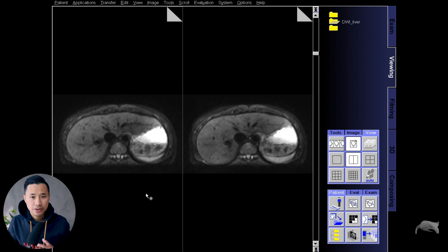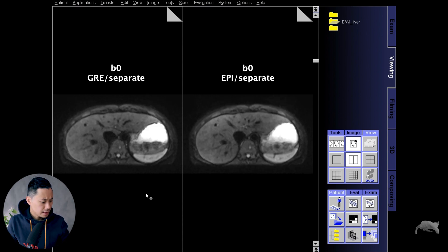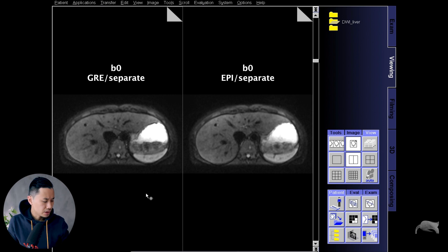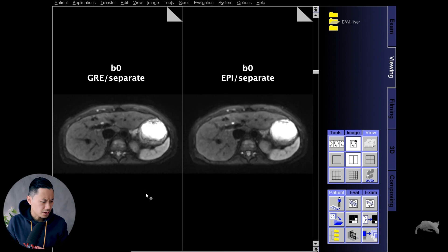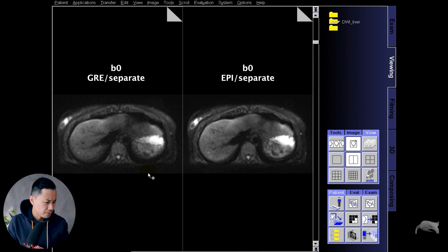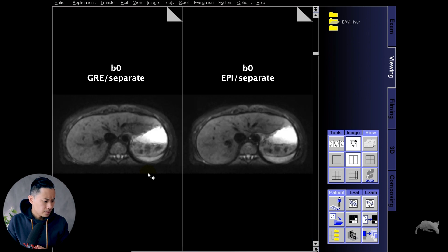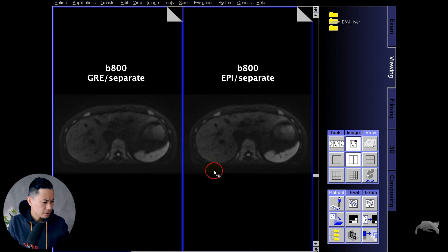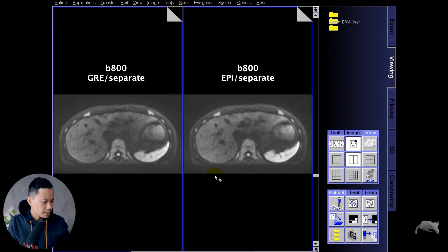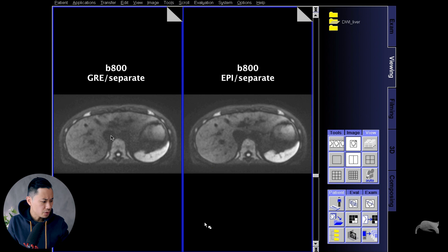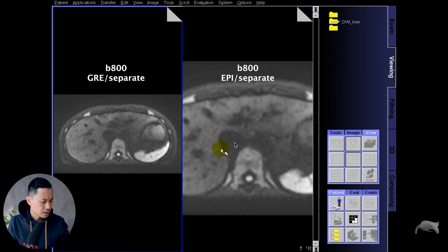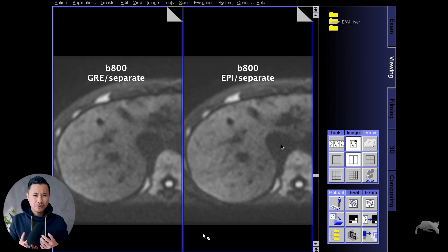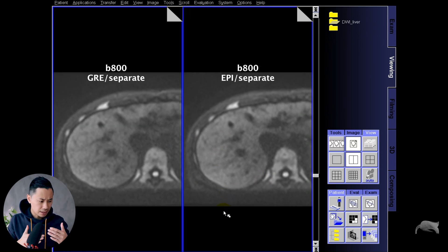Let's check the results. Currently we are in the viewing mode. This is B0 — here you have the gradient based, here you have the EPI based. With the B0 it seems alike, nothing very different. Let's go to B800 and you will see a difference. Zooming in and adjusting the window — look at the mid part right here. It seems a little bit more noisy with the gradient; with the EPI it's less noise. That means with the EPI you can push the limit a little bit further without seeing the noise in the middle part.